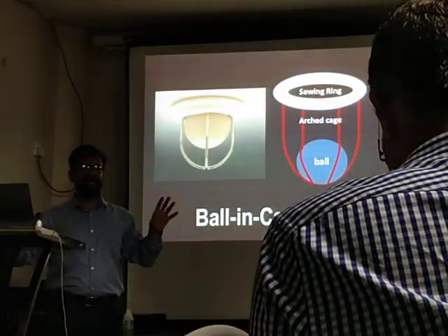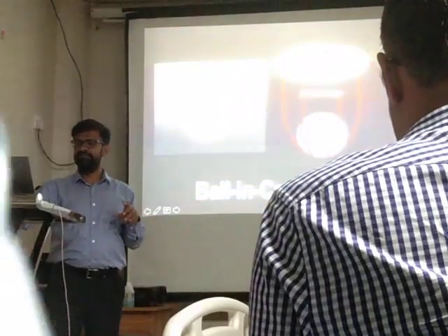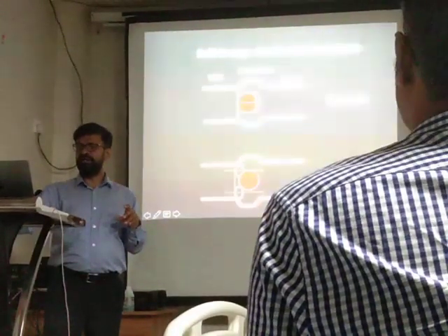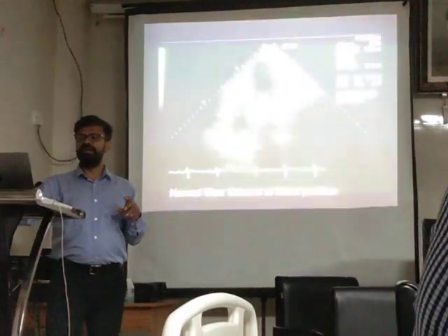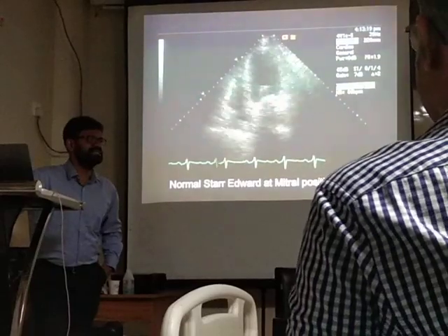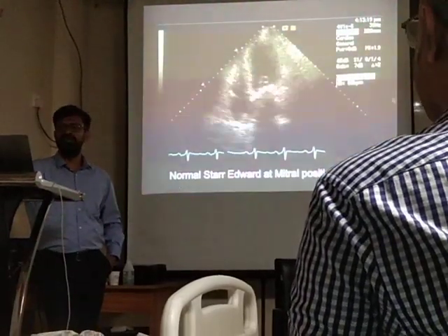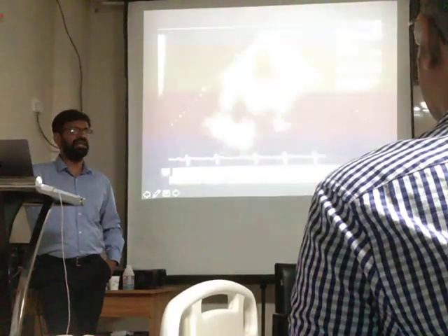Right? So, I am going to tell the mechanics slightly. This is ball in cage. And as you see, there are 4 arms. This is the way it looks. Echo-wise, patients come even 40 years later, many are still alive. But you should have this dot in the LV cavity.